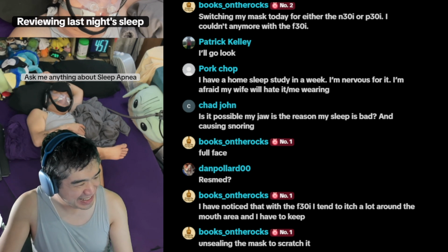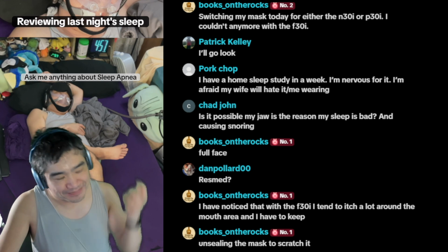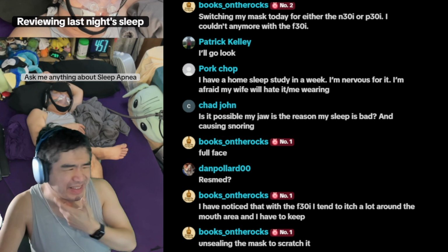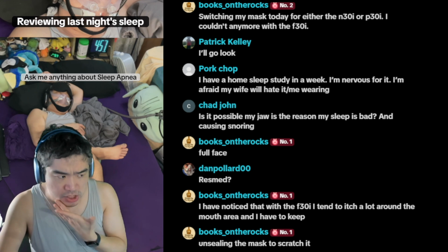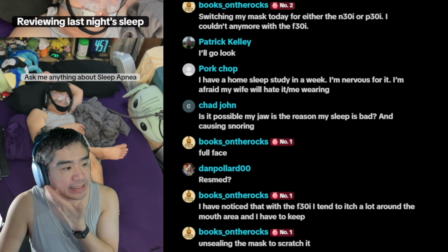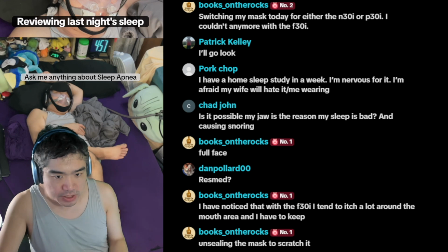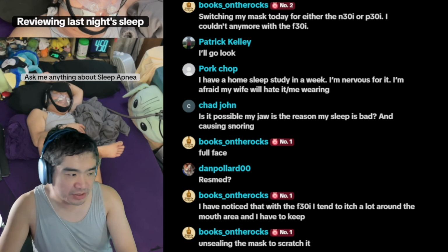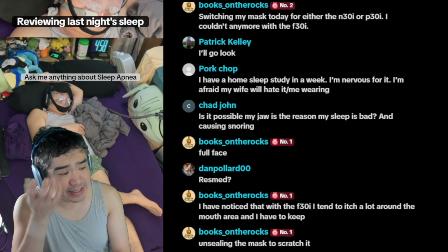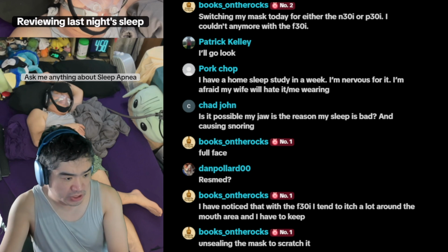Oh man. Yeah, and that's a good point. A lot of times, before I added on the extra layers of protection, like the chin strap and such, even the chin strap can get a little irritation. So I would scratch under it, and I can easily see one of those scratches turning into a full unmask. So again, you may not be so amenable to adding more straps, especially since I think the nasal mask would be a lot more low profile for you.